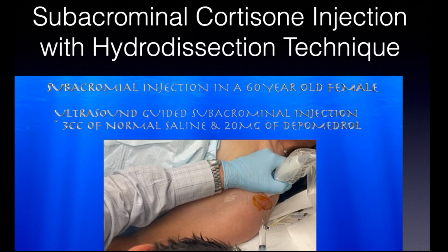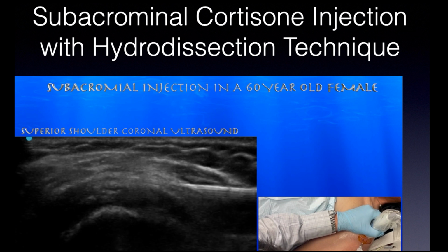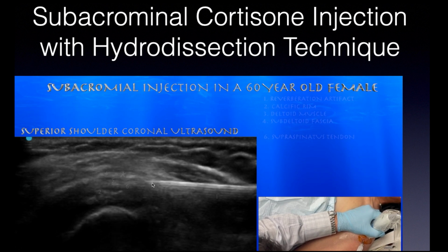So here she is, lying supine. It looks like I'm using a 22 gauge needle. I don't have a sterile drape, but everything else is sterile. And I'm just trying to get it into this sliver here.